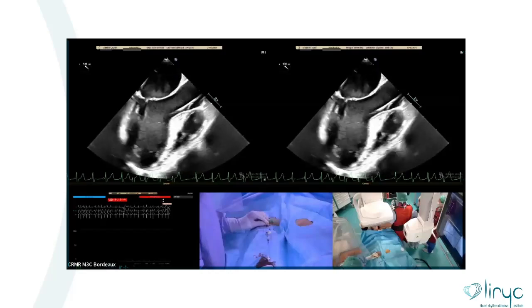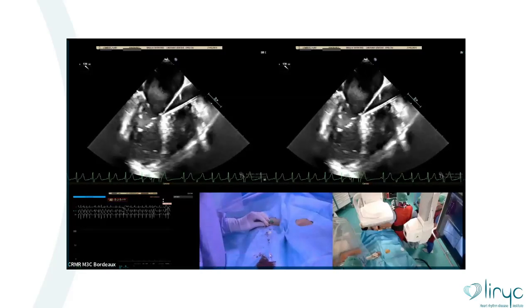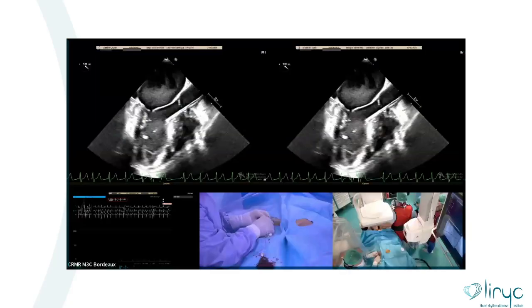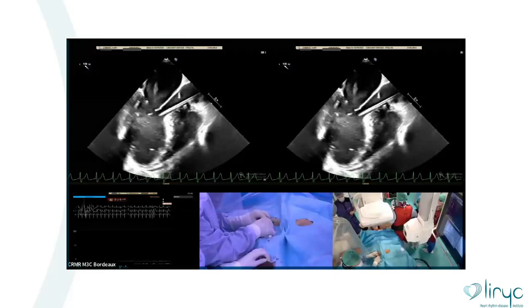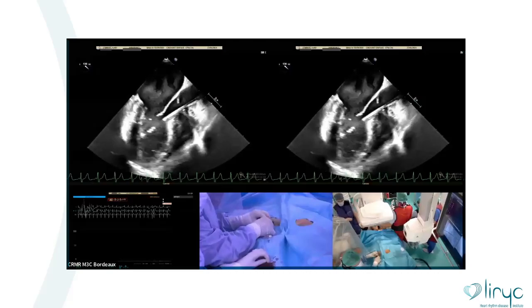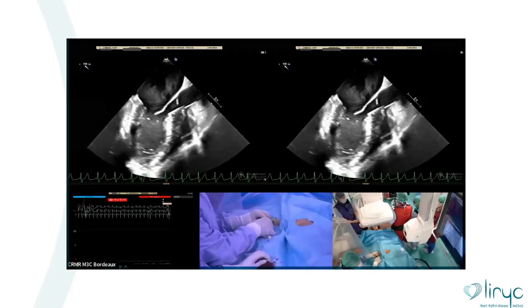Ouais, le guide là pour voir. Non, on est trop profond, hein, JB. Ouais, voilà. Ok. Bon, donc, prends le guide, toi. You should advance the wire. Montre-le. Hein? Montre le guide. Je pense qu'il est sorti là, tu vois. Ouais, mais il faut qu'on voit où est le cathéter, hein. Mais tu le vois pas. Advance the wire. Oui, attends, montre le guide. Voilà. Okay. Use the wire to help.